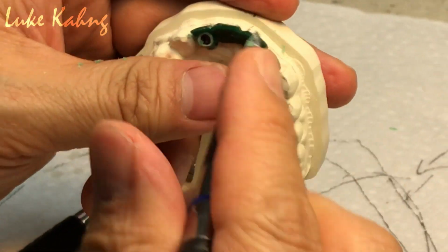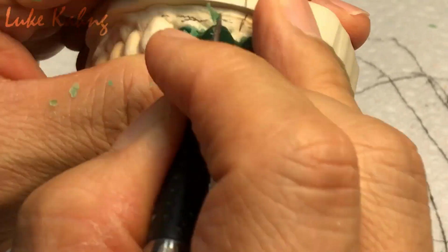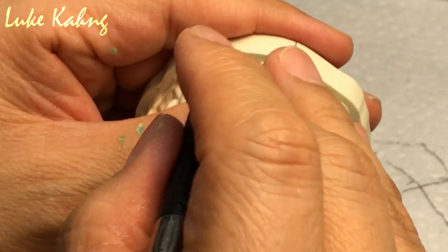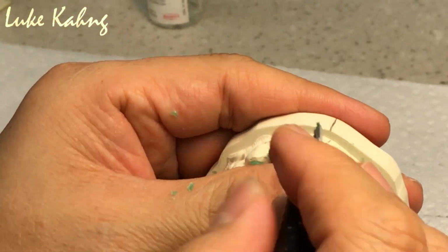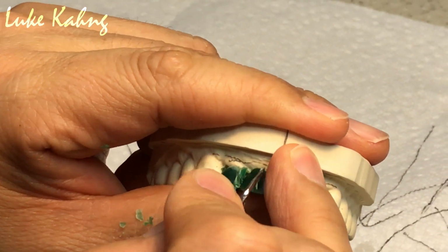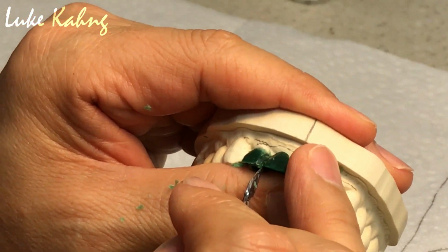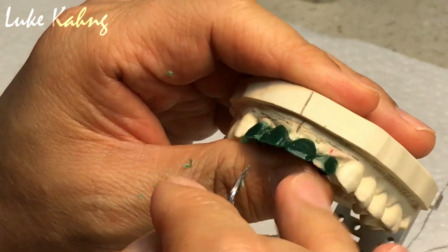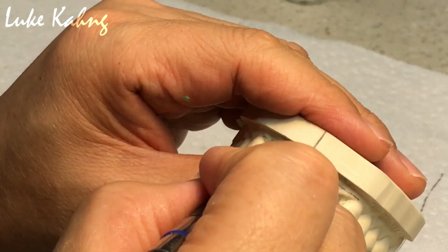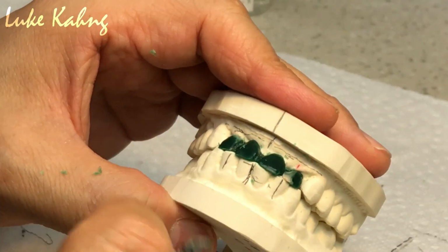Now I do U-shape between this, cut it. I don't need perfect here. You see, I do not need this. Now size is getting better, identical, duplicated, clone. It's better. Better. Same thing. You can add here a little bit.